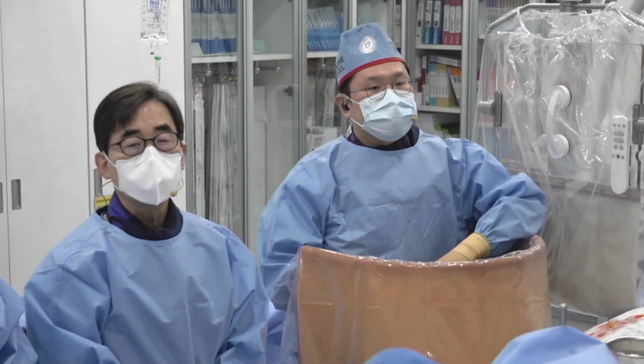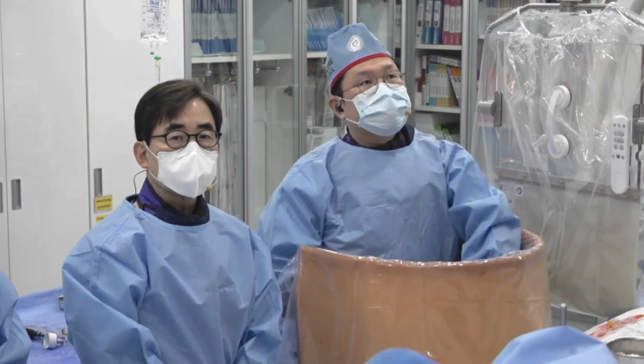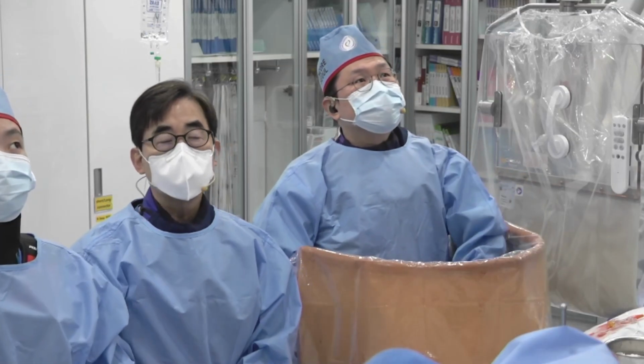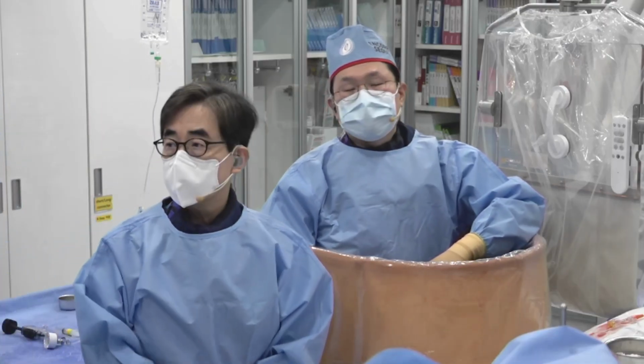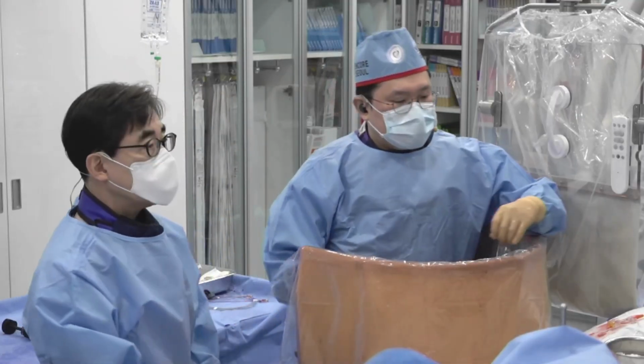I'm Hyo-Soo Kim from SNU Hospital. First operator today is Dr. Jung Kyu Han and Dr. Hee-Jin Lee and Dr. Yong-Gu Lee, and many other staff are standing. Okay, Dr., would you please present your case?